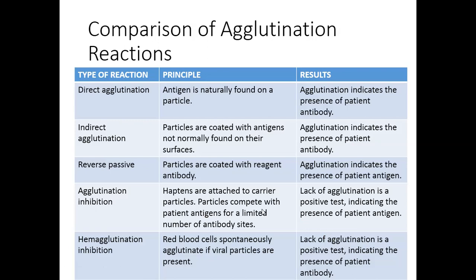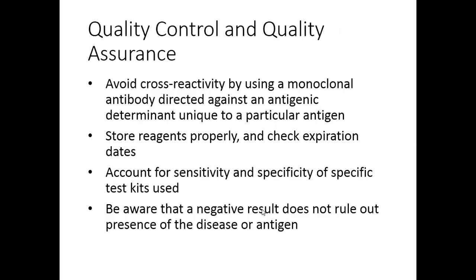Here's comparisons of the agglutination reactions. You can follow along with those. Then quality control, our last slide. Yay, thank you for your patience, people. Quality control and quality assurance. Couple of things just to remember.